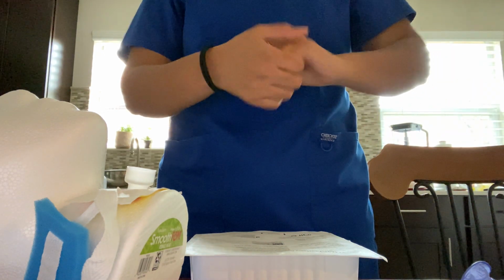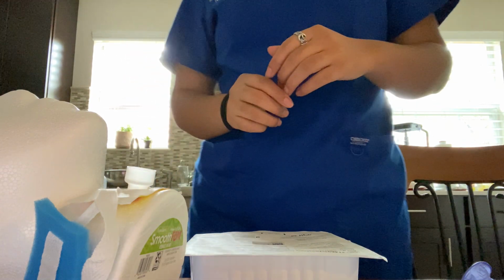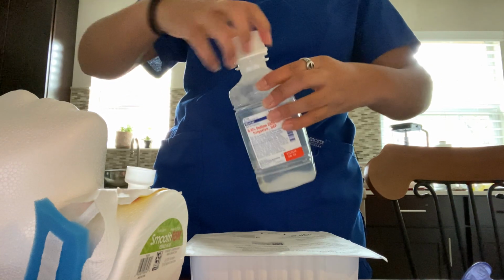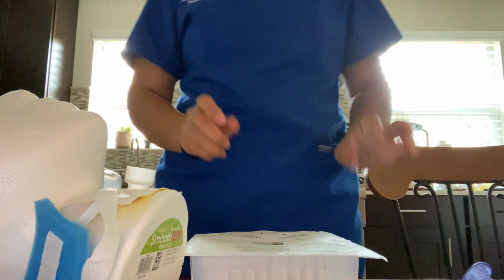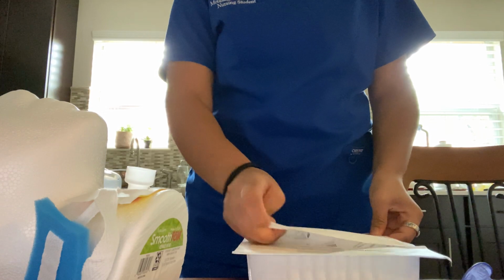Okay, performed hand hygiene. And now we are going to have the saline open before we open the kit. So here's our saline. It is open. Okay, hands are clean. So now we're just going to open our kit, maintaining sterile technique.